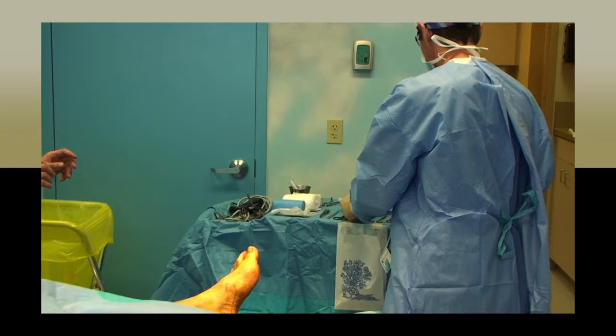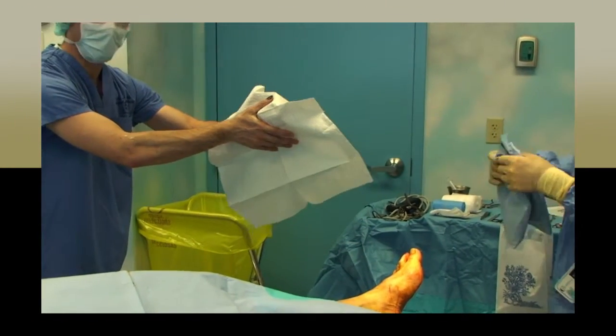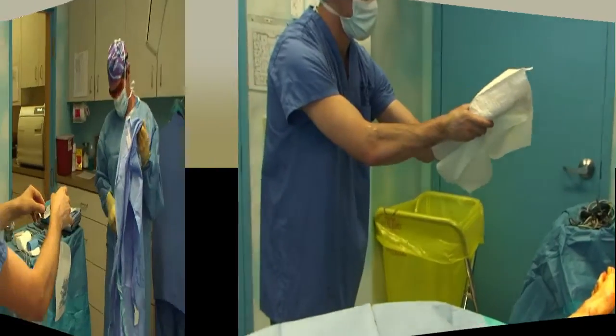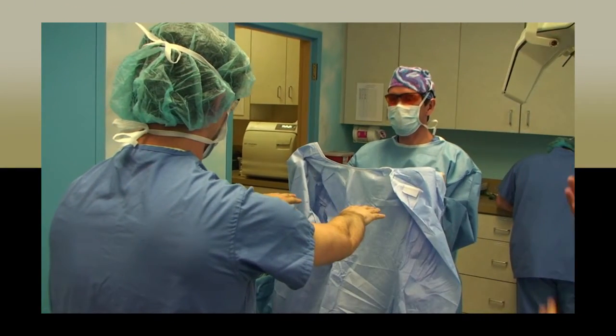Your sterile field has already been prepped by the circulator, and now that you have donned the sterile gown and gloves, the physician will scrub in and enter the case. You will be in charge of helping him or her gown and glove. To do so, you will have him or her grab the white towel on the gown and completely dry their hands and arms. You will grab the surgical gown by the front neck corners, being sure to pull the corner around your sterile gloved fingers, because you will be close to the person's neck as you help them place the gown on. You will drop the gown toward the ground, opening up the inside surface of the gown.